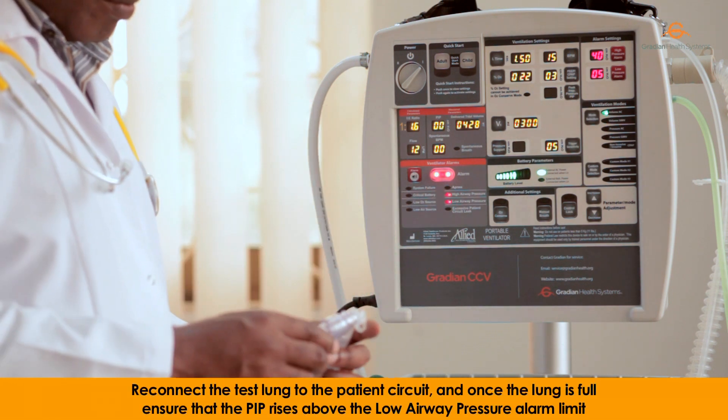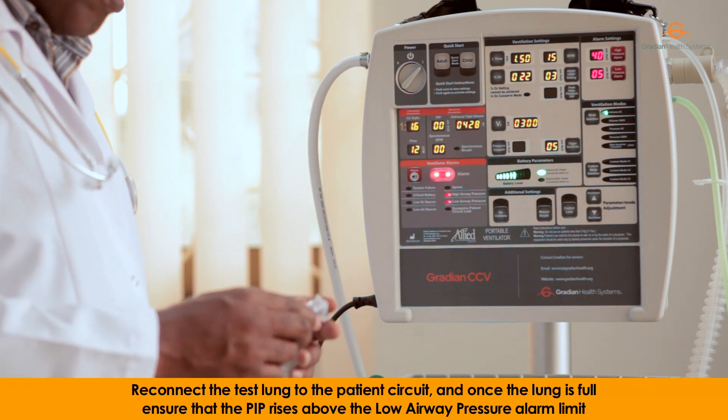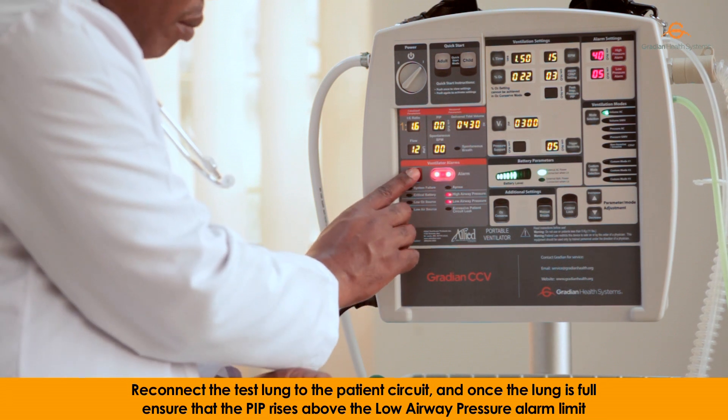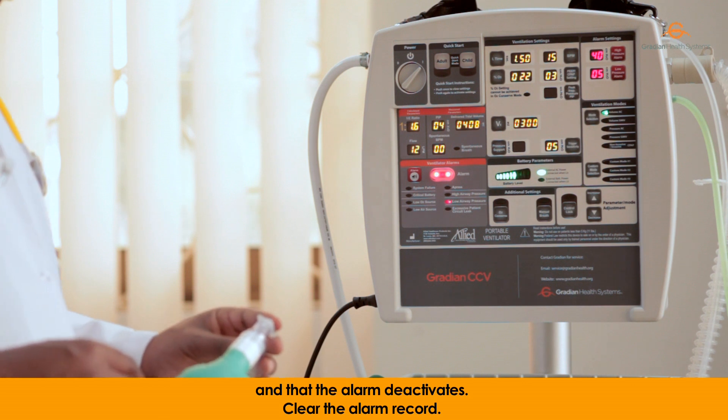Reconnect the test lung to the patient circuit and once the lung is full, ensure that the PIP rises above the low airway pressure alarm limit and that the alarm deactivates.